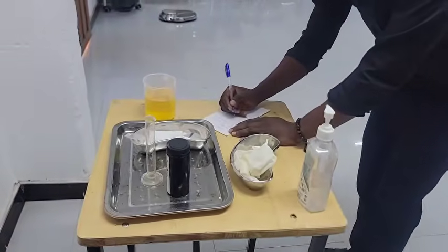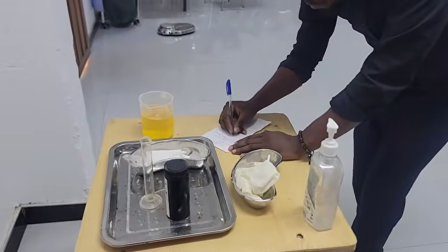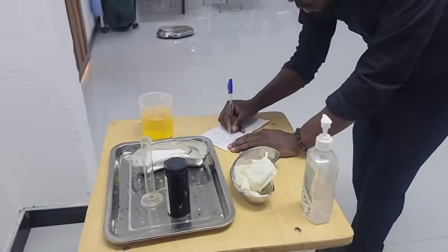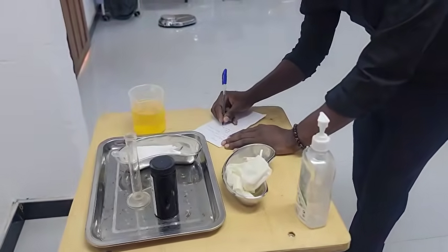And then for the contents, so there is no pus. You say no pus, no blood, no physical properties.